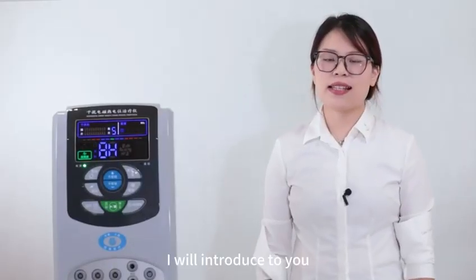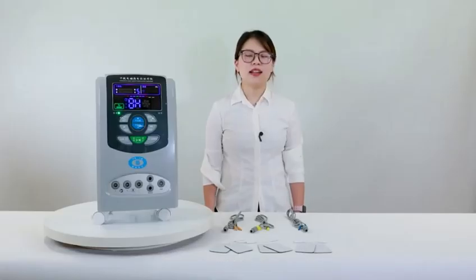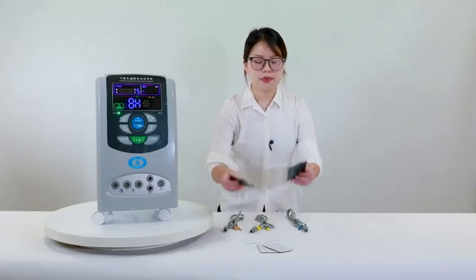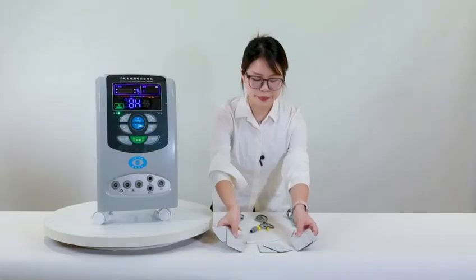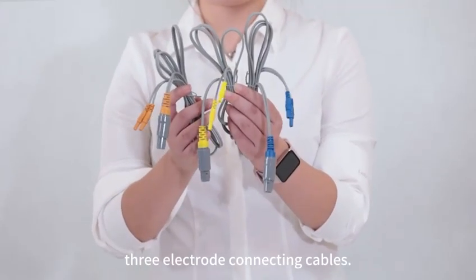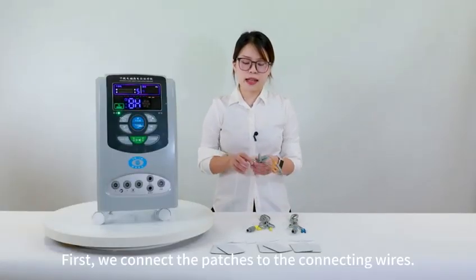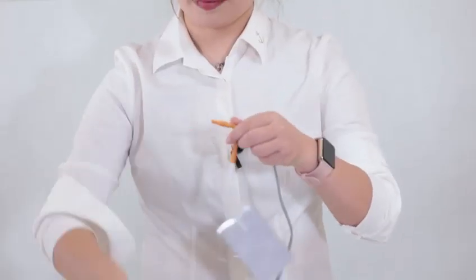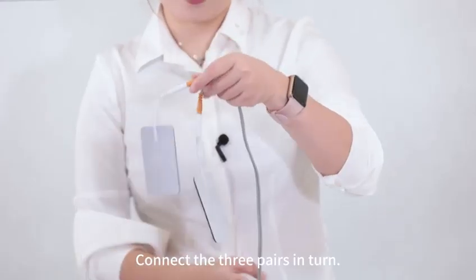Next, I will introduce to you the fourth function of this instrument, the interference current function. The accessories required for the interference current function: 3 pairs of galvanic electrode patches, 3 electrode connecting cables. First, we connect the patches to the connecting wires. Connect the 3 pairs in turn.